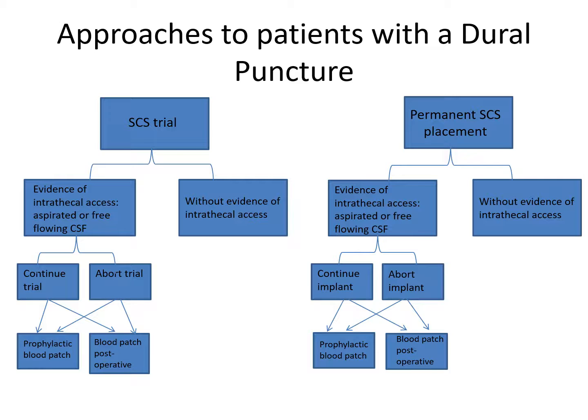have the decision to either continue the trial and access the epidural space at another location or abort the trial completely. Either way, the provider also has the decision to perform a prophylactic blood patch or evaluate the patient postoperatively. In this respect, a prophylactic epidural blood patch has not been advocated in the literature to reduce the risk of post-dural puncture headache. However, in this specific scenario, if an epidural blood patch is performed at the time of the dural puncture, it can be performed in the operating room under sterile conditions and with contrast dye spread for verification at the level.